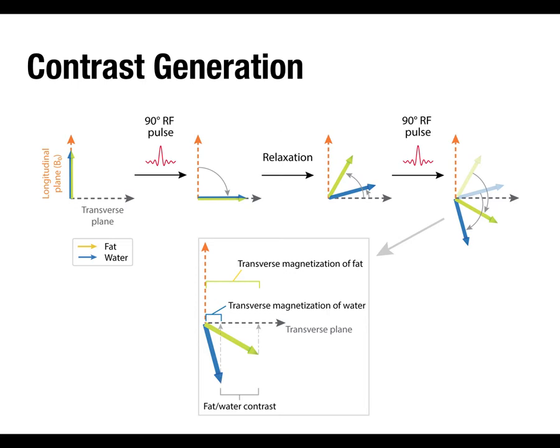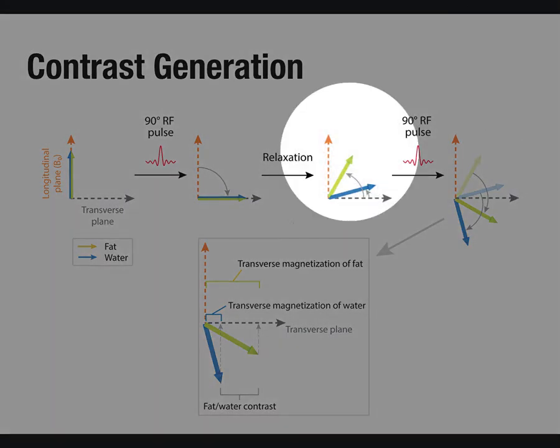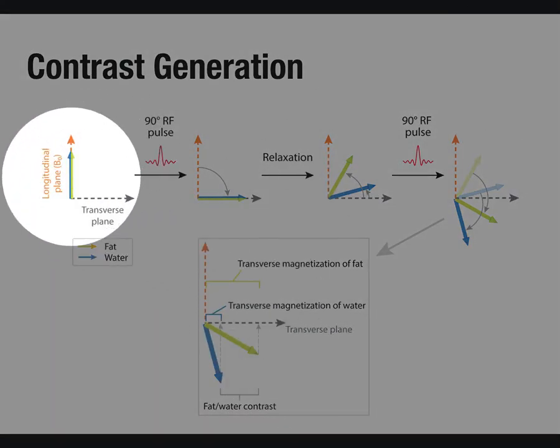All right. And this is just another figure that's basically illustrating the same thing and breaking it down more. Repetition never hurts. So again, here we've got this representation where the longitudinal plane, B0, that's the bore of the scanner, the main magnetic field, is pointing up. Then our transverse plane's pointing sideways. So at the start, before we've done any RF excitation, all the fat and the water protons are lined up, more or less, with B0. And so you see the blue-yellow arrow there.